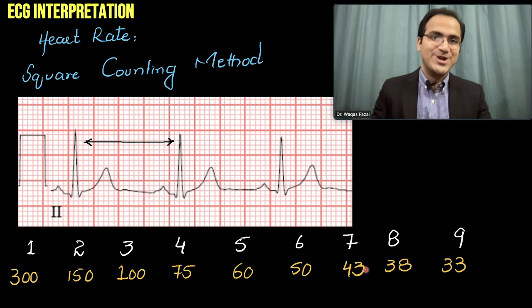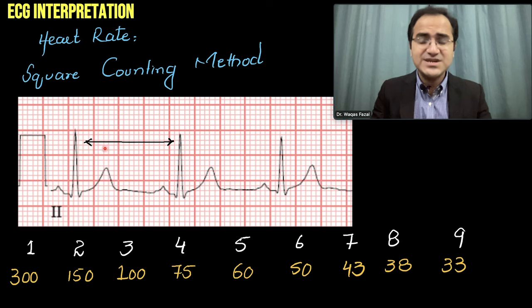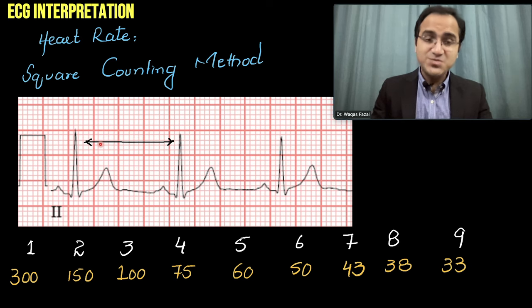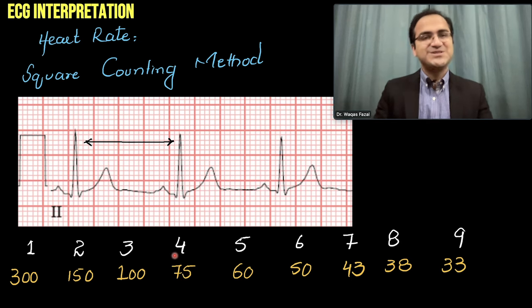Looking at this ECG, there are almost four large boxes between the QRS complexes, so the rate of this ECG is 75 beats per minute. This is the simplest method to calculate rate from an ECG.